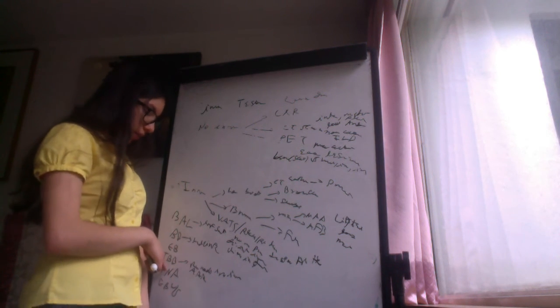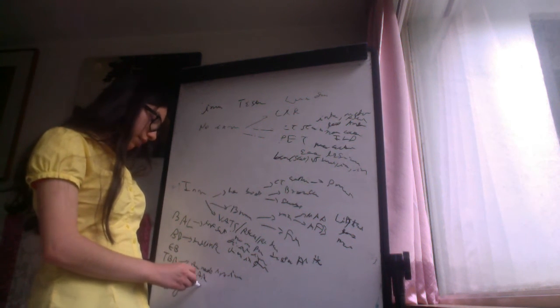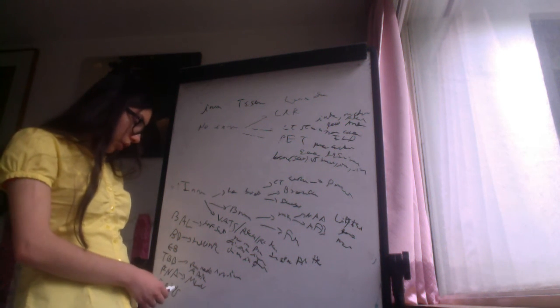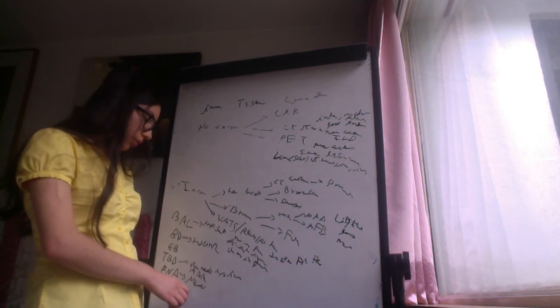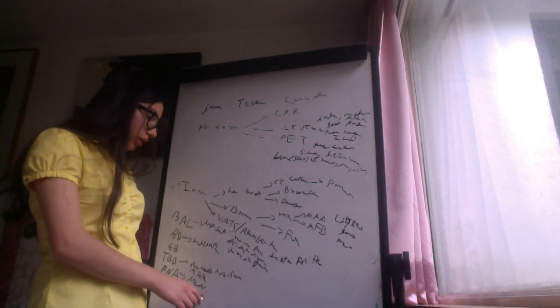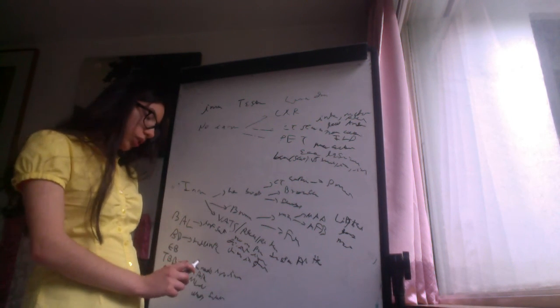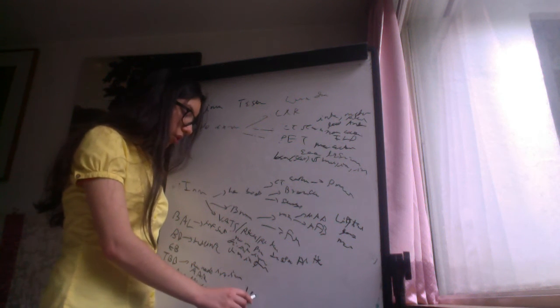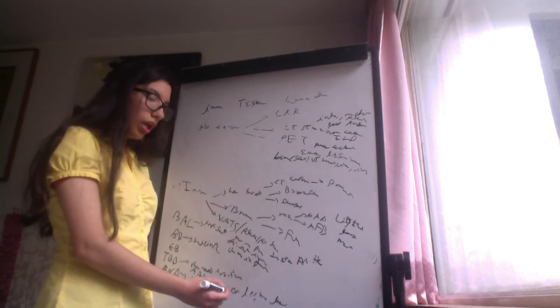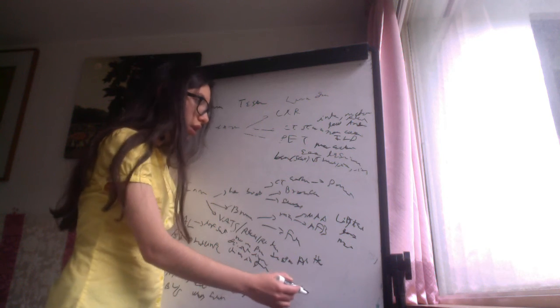The fine needle aspiration is to assess metastases in mediastinal lymph nodes, and the endoscopic bronchial ultrasound is done to assess the wall of the airways and the surrounding structures. The indications will be endotracheal lesions, mediastinal lymphadenopathy, and lung cancer in order to do the staging of the lesion.